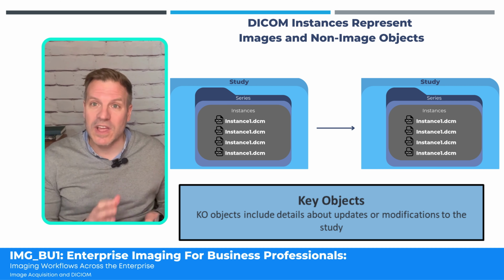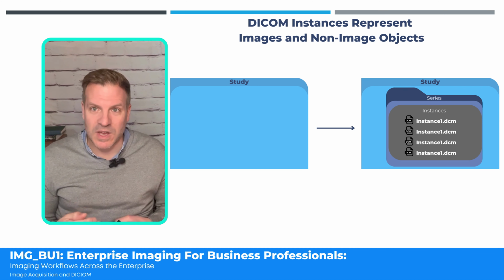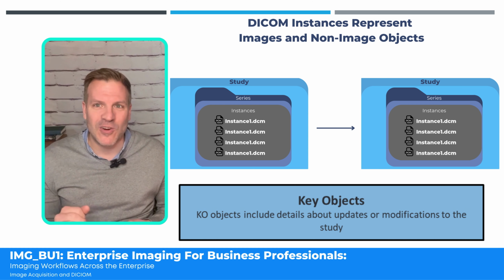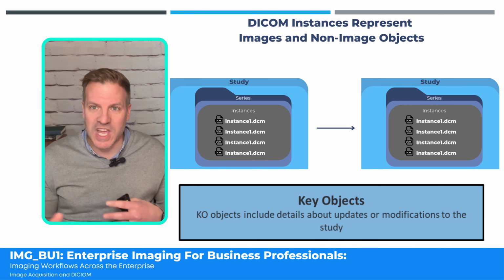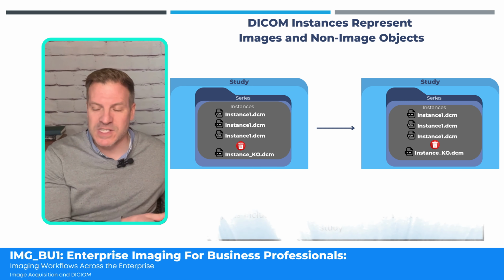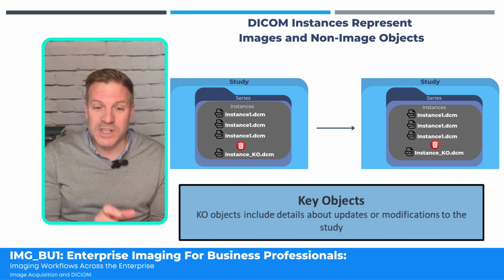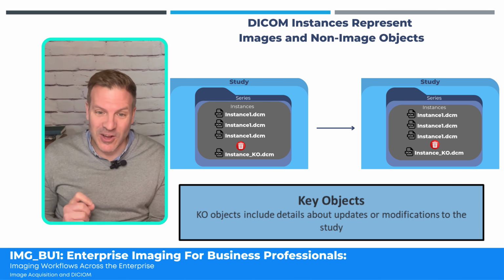This is where key objects can come in using IOCM, which is a profile called Image Object Change Management. We'll touch on that later on, but key objects allow us to communicate some of those changes to say 5 images have been deleted. We're not actually sending an image to inform that. We're just sending a non-image object type called a key object to inform that update.